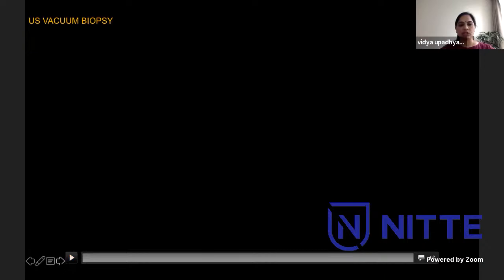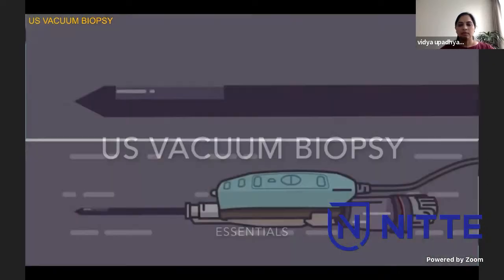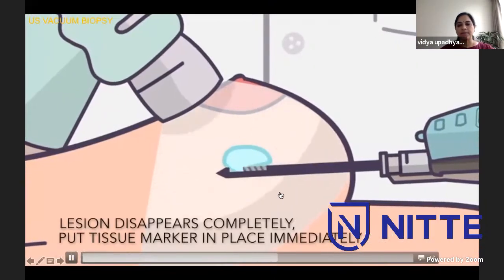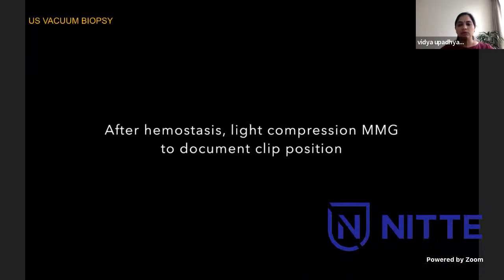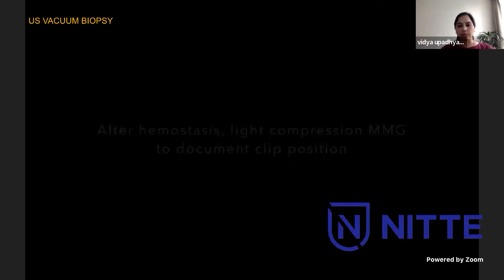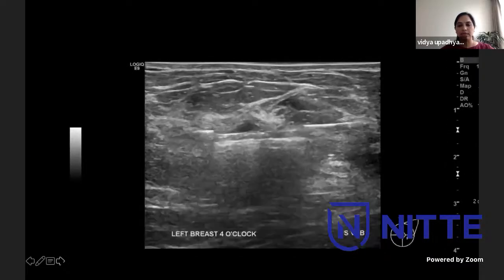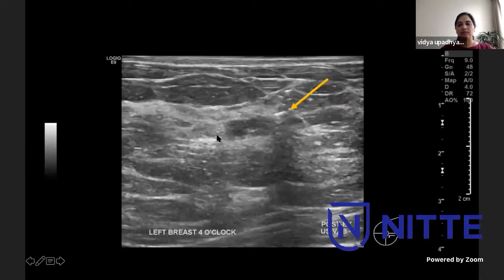Some essentials of vacuum assisted biopsy: the needle uses vacuum aspiration and a rotating cutting needle. Tissue is collected in the basket and almost the entire lesion disappears. We then put a tissue marker to mark the biopsy site, after which hemostasis is achieved and a light compression mammogram documents clip position. On screen during vacuum assisted biopsy, you can see the lesion and the trough of the VAB needle, and how the lesion disappears. This is well documented by the sonographers. Once the lesion has completely disappeared, we put a clip in and document with a light compression mammogram.